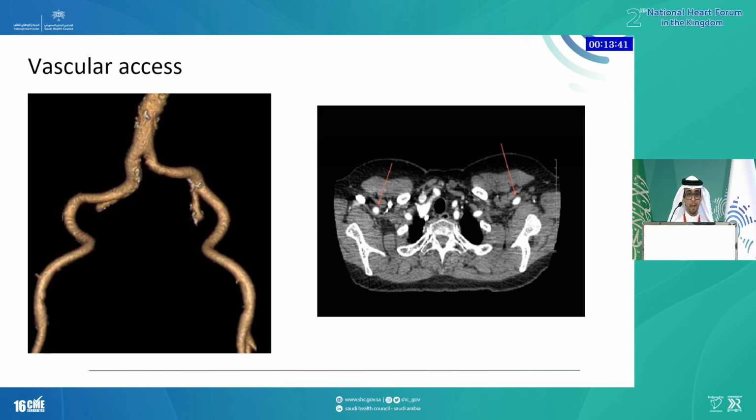If the artery is not suitable for intervention because of the diameter or calcification, then you have to look for other access like the subclavian or carotid artery.